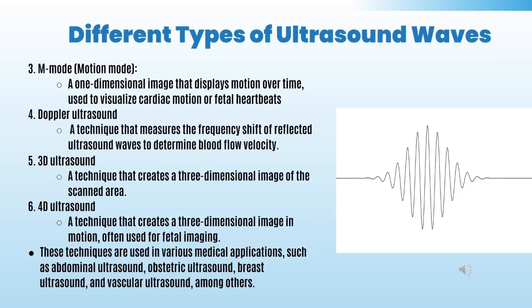It's used a lot in OBGYN and other modalities, but predominantly it grew to be pretty popular in OBGYN. Also, 4D ultrasound is pretty similar to 3D, but it allows for movement. It's a technique that creates a three-dimensional image in motion, often used for fetal imaging.